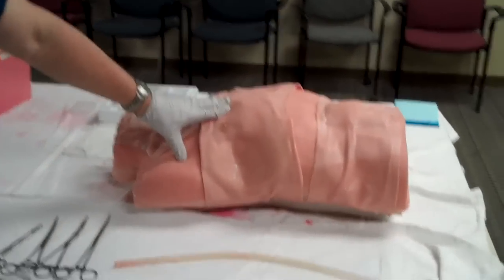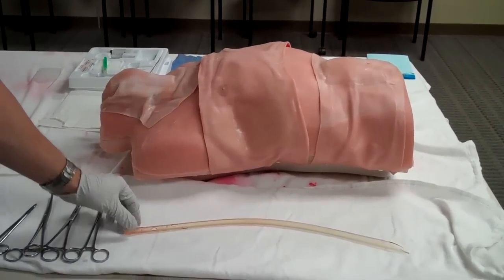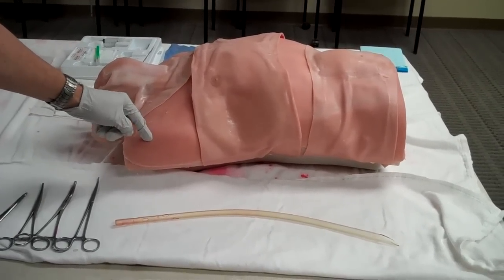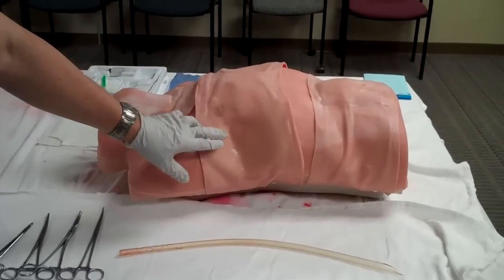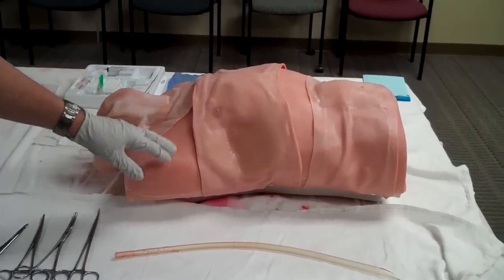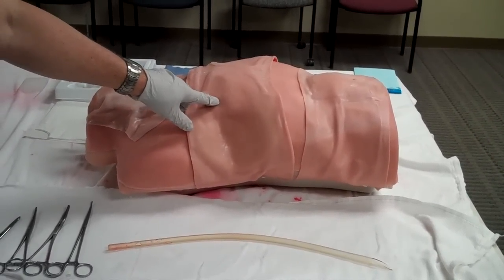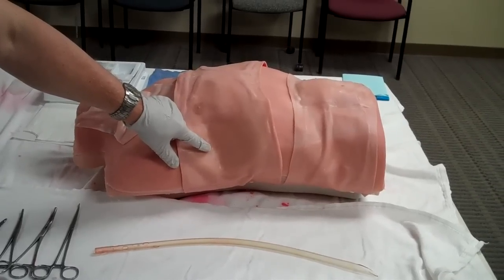Now, after you've selected the tube size, and we'll use big, 36 French in this case, you need to pick your location. Ideally, you would like to put this in about the fifth intercostal space, either in the anterior axillary line or mid-axillary line. The easiest way to determine where the fifth intercostal space is in a male is that it is the soft spot right below the nipple, and it tends to curve around like this.